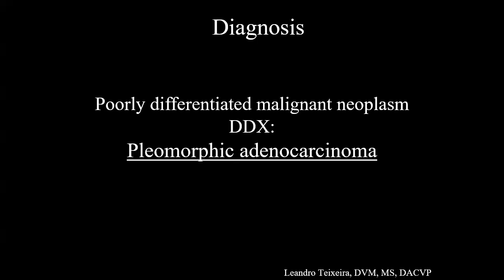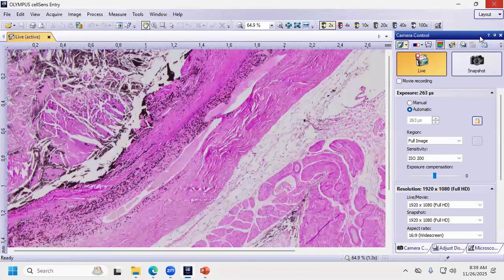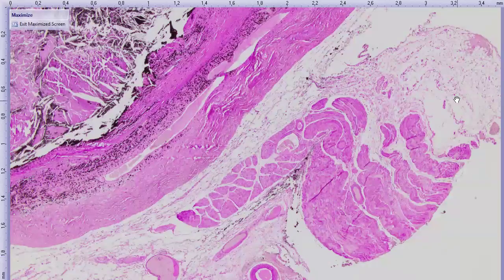Question? Yes, there is a request that if there's time, could you show the PAS of the round pigmented mass and the other neoplastic epithelial cells in the cornea? Yes, the pigmented portion in the cornea, is that what you're saying? Okay. And then there's also a question of whether we know if there was any staging done for mets.